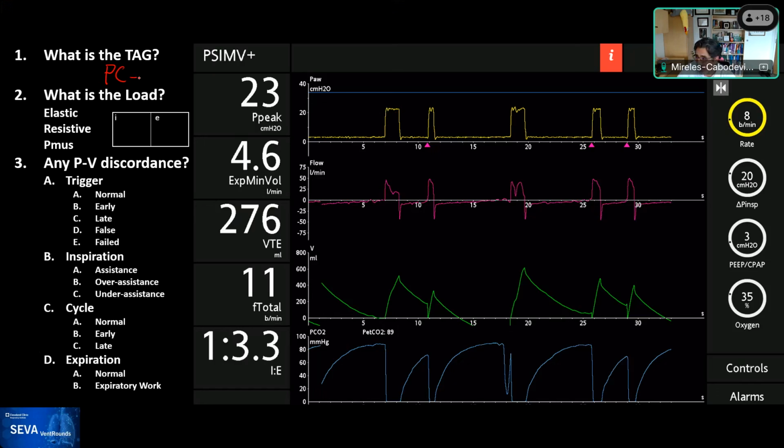Simran and Fernando said, oh my, this is IMV, and they feel strong about that. And we have some hints to tell us that this is intermittent mandatory ventilation. Just by looking at the breaths, we can certainly say that the first breath is mandatory. This one that I put an M on, we know because it's not patient triggered, and that immediately makes it mandatory. And there's another one here that is also mandatory.